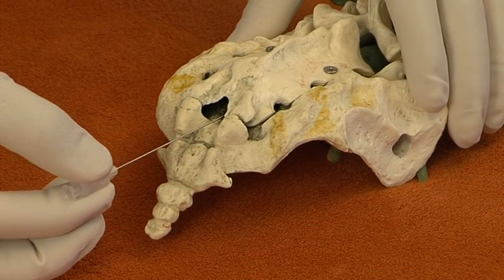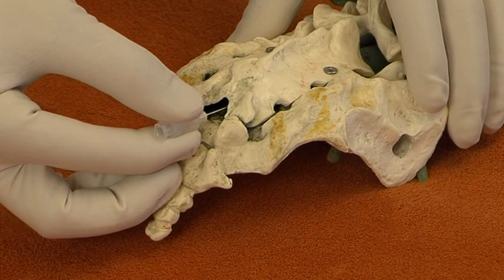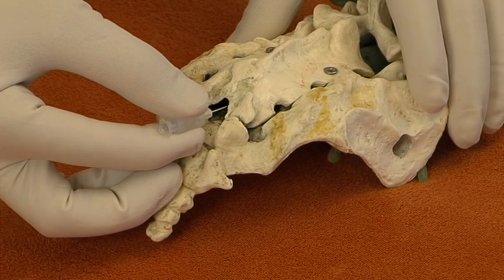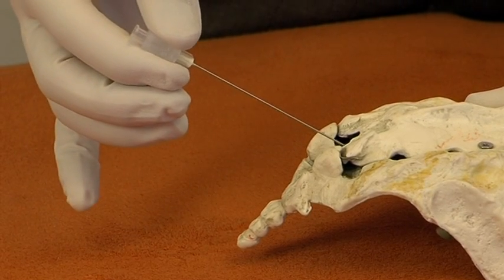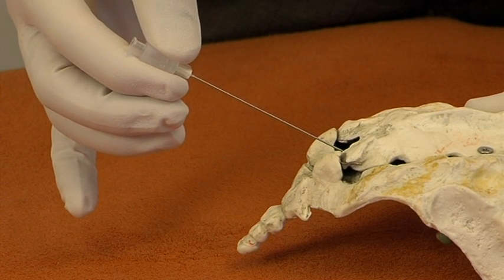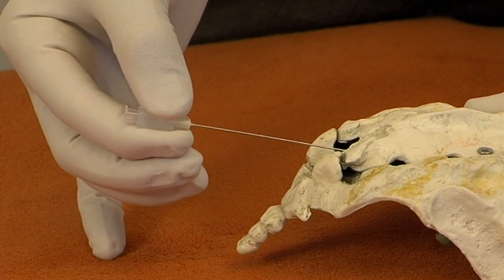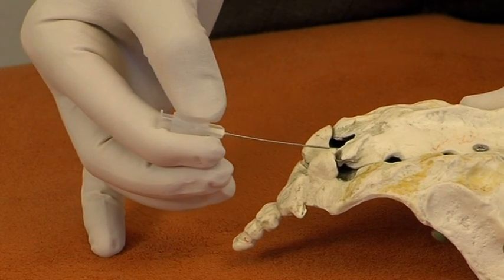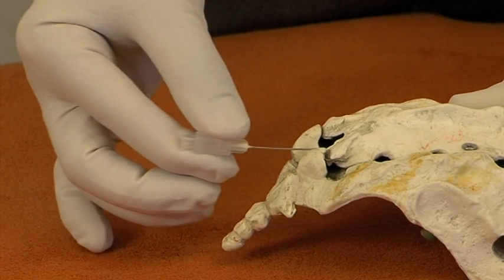After piercing the intercorneal ligament, the needle is advanced. It may slip intrasacrally without further ado. If it reaches bone in the sacral canal, then the needle is withdrawn slightly and directed more horizontally, conforming with the shape of the mid-sacrum. By bending the needle, these two steps may be combined.